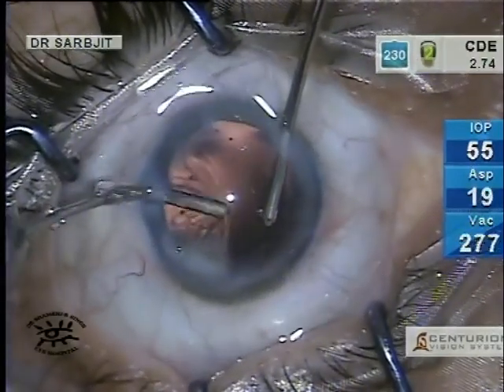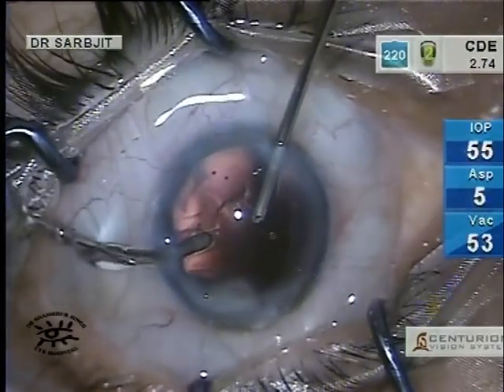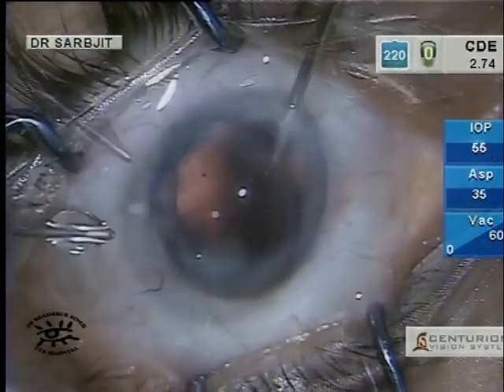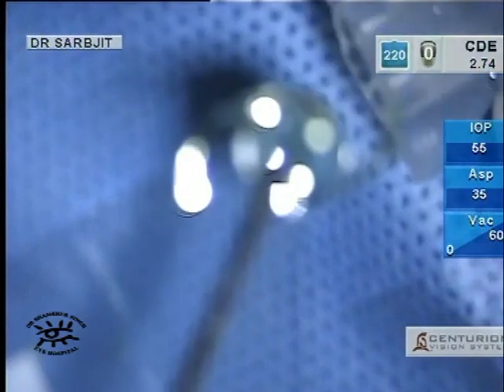400, 500 — you're not worried about any surge. Viscoelastic is injected to reform the chamber.